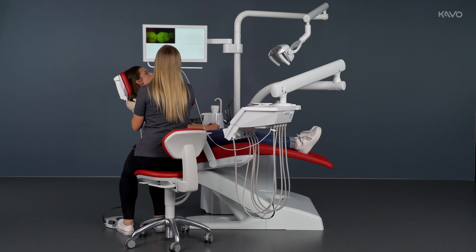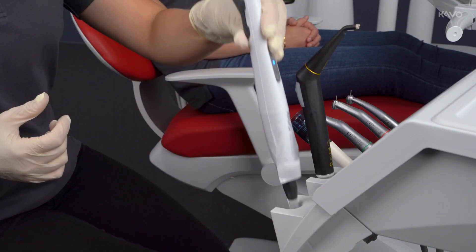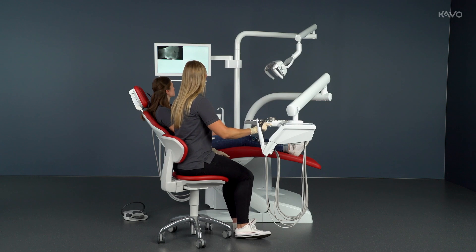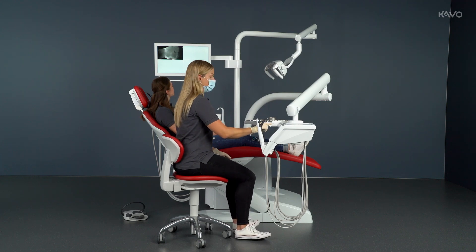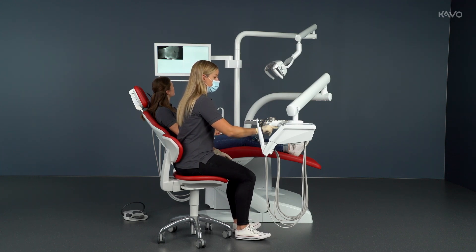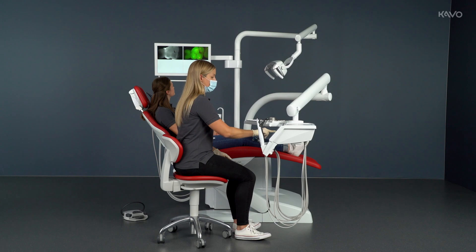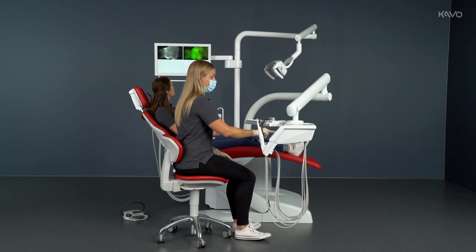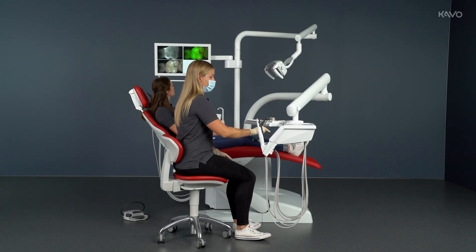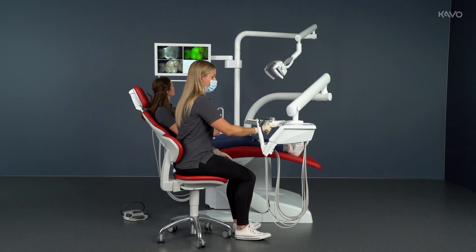The images are displayed on the treatment unit screen and can be compared with previously saved images. By using the Carvo cameras on the treatment unit, you have instant access to your camera images, and these can then be exported via USB.